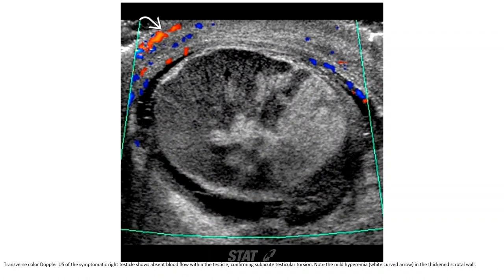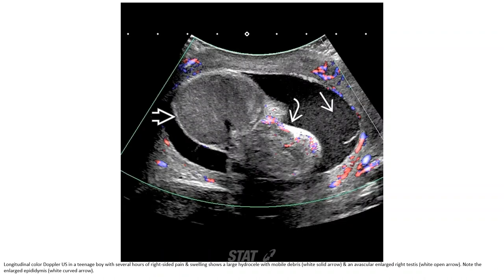Color Doppler ultrasound of the symptomatic right testicle shows absent blood flow within the testicle, confirming subacute testicular torsion. Note the mild hyperemia in the scrotal wall. Color Doppler of a teenager boy with several hours of right-sided pain and swelling shows a large hydrocele with mobile debris and an avascular large right testicle, with an enlarged epididymis.